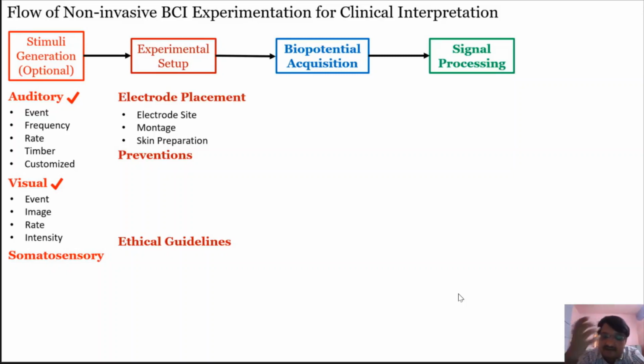I already mentioned that for a wet electrode you need to prepare your skin. When a subject comes, it depends on where you are going to take your recording. You have to wipe it with spirit, and then there are specially available pastes or creams that are used. That will make sure you get the best response with your electrode. Mostly in the case of wet electrodes, skin preparation will be required.